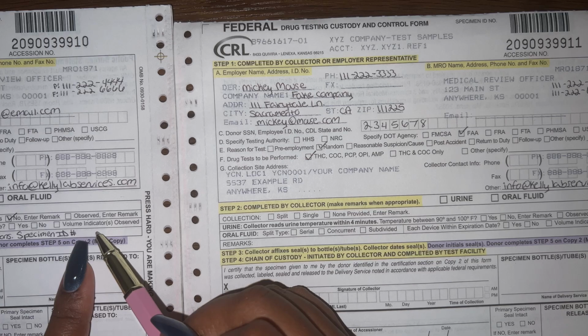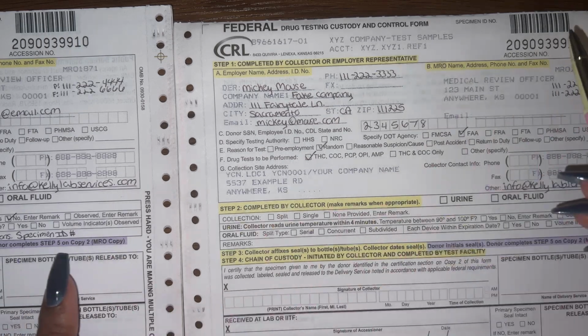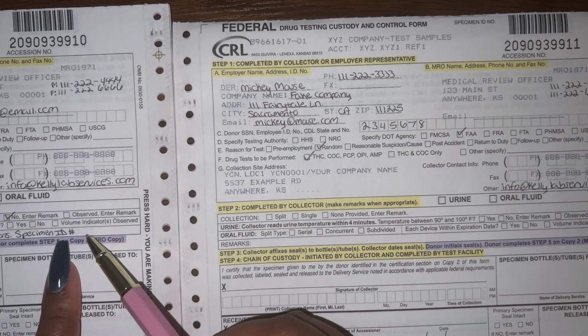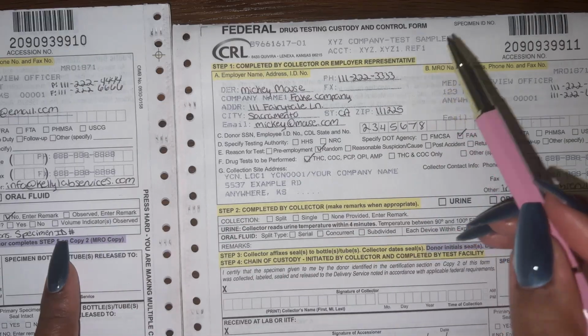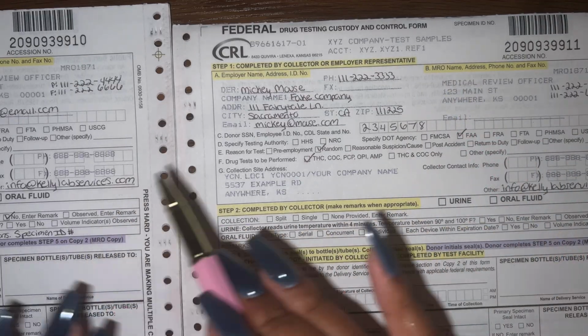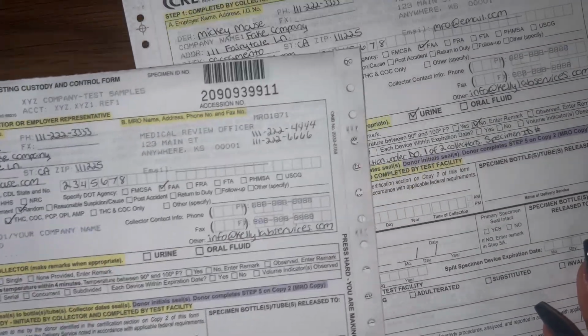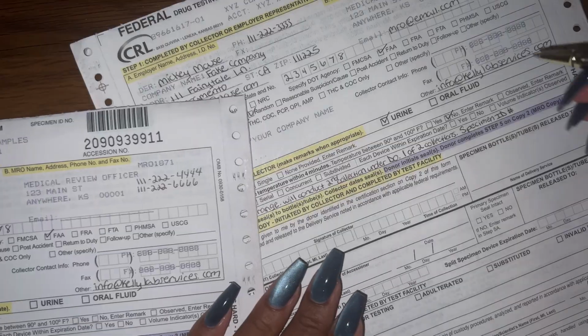They need to reference each other. So we're going to take this specimen ID number from CCF number 2 and put it over here on CCF number 1 for temp out of range, so that it references this one. That way everybody knows these two go together. Now back that up and replay it if you need to, so that you understand over and over again until you get it.